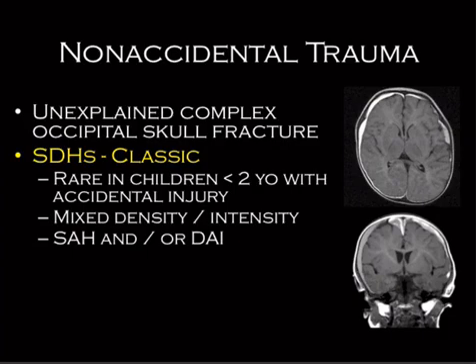For the purpose of the test, think subdurals, especially subdurals of different age in a pediatric situation, or if they show you blood in the orbits, like orbital blood, then that's another thing to think about for non-accidental trauma.